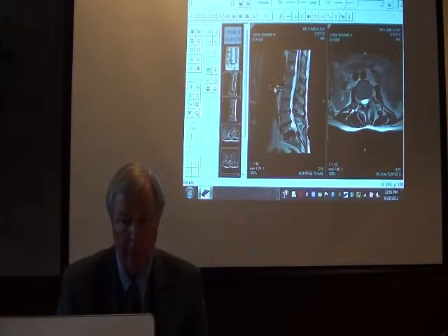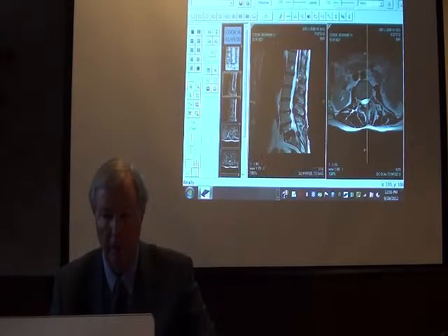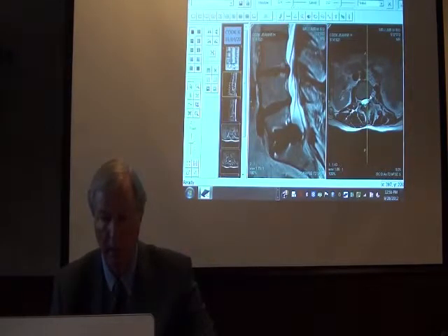This again is the lateral view. This again is a cross-sectional view. So again, we're seeing the entirety of the lumbar spine. Again, you see the tip of the spinal cord here, or spinal canal. You see the sacrum. This is our operative site. L4-5 disc, L3-4 disc. We'll go ahead and zoom those a little bit. This is a cross-sectional view. We can zoom.